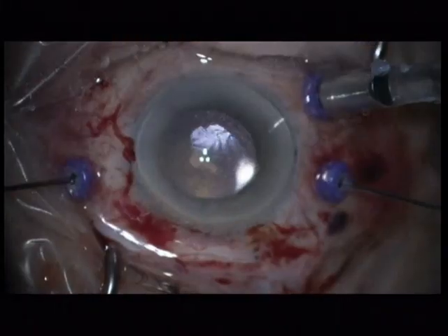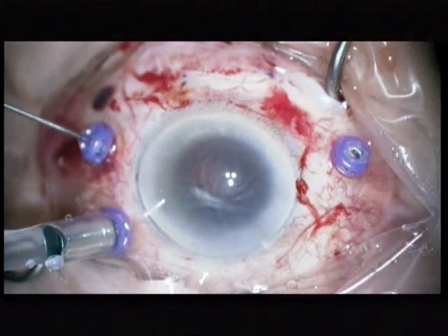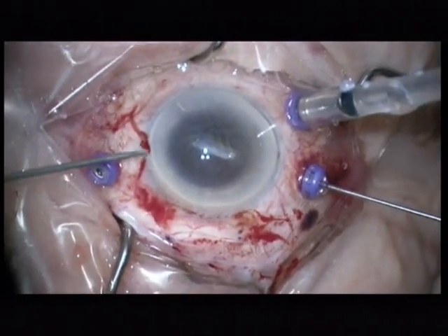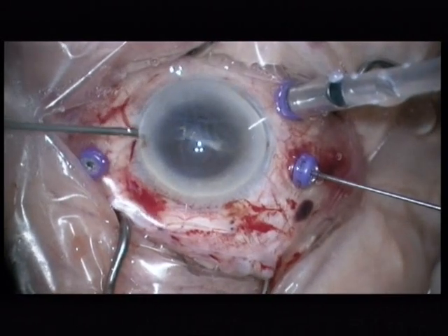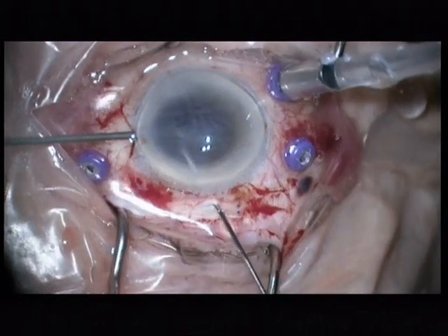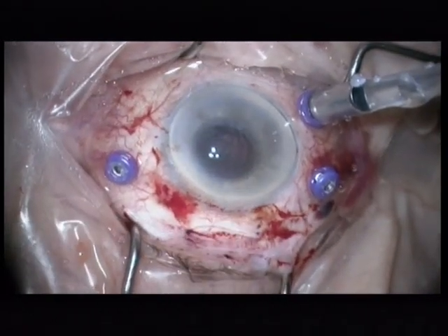I will first open the scleral tunnel. The left hand has the light pipe and the right hand has a 27 gauge intravitreal forceps. I grasp the IOL and elevate it to the pupillary area. There you can see the IOL behind the pupil. The left hand takes a second forceps and takes over the IOL. Now I reintroduce the first forceps through the scleral tunnel, grab the IOL and extract it. So this is the first item which is removed.